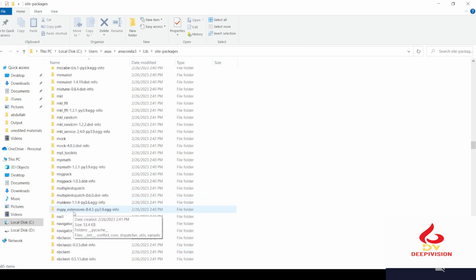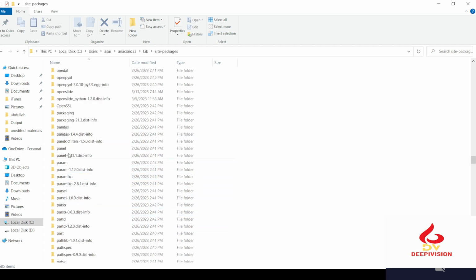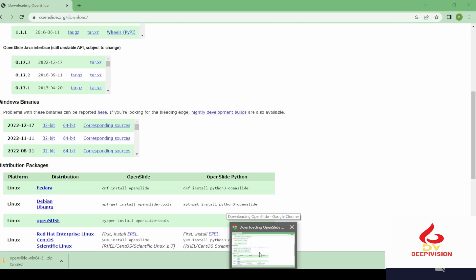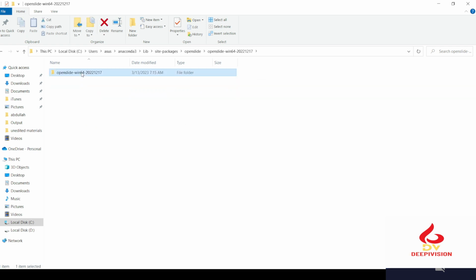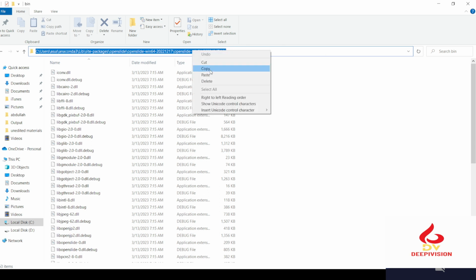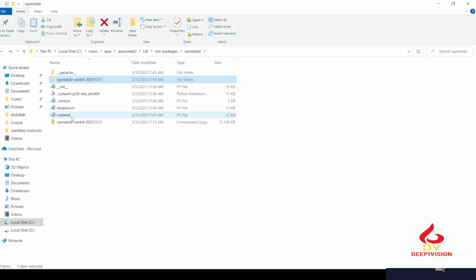We will check here openslide. Yeah, this one. This is the OpenSlide window. There's that zip file we already downloaded from here, and it comes in the form of a zip, and we unzip it. Okay, and just copy this path, copy, and come here, lowlevel.